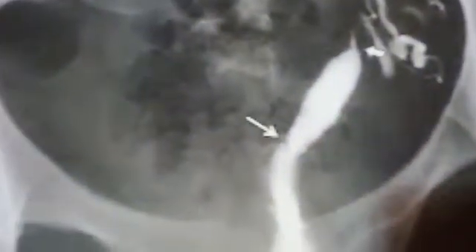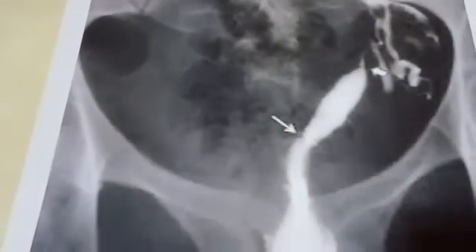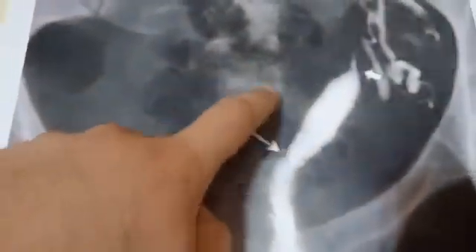This hysterosalpingography shows only half of the uterus and one fallopian tube with peritoneal spill on one side. This is a unicornuate uterus — only half the uterus is present with one fallopian tube, because only one Müllerian duct developed.